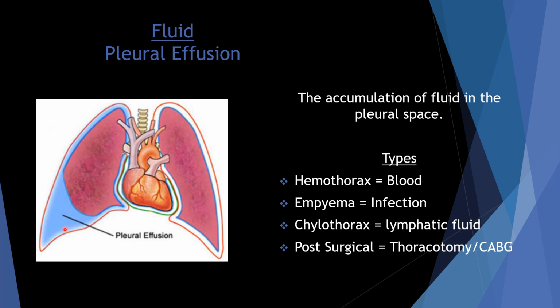And as you can see, now what has it done? It has actually changed that pressure in there. It's probably creating a higher pressure, pushing that lung up, right? So now you don't have that -2. You've got a higher pressure in there, thereby not allowing the lung to fully expand and giving us decreased surface area for gas exchange.